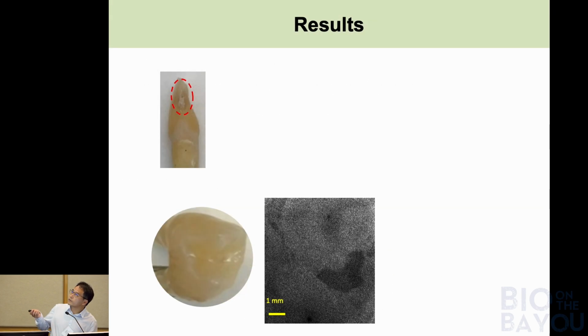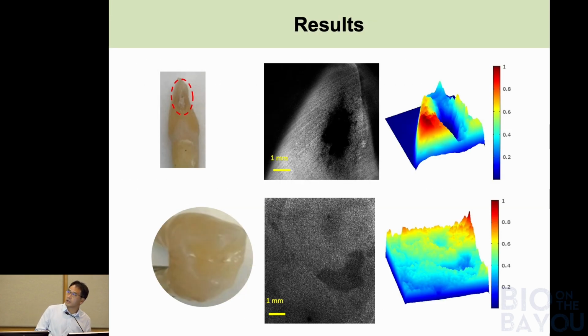So as a result, I just put all of them here. Now I show 2 typical results from 2 kinds of teeth. First of them has a white lesion, a typical lesion that you can see with the eyes, and for this you typically need a filling. The advantage of this device is, in addition to detecting those that can be seen by the eyes, it can also show changes of mineral concentration in teeth that appear normal to visual examination or standard cameras.